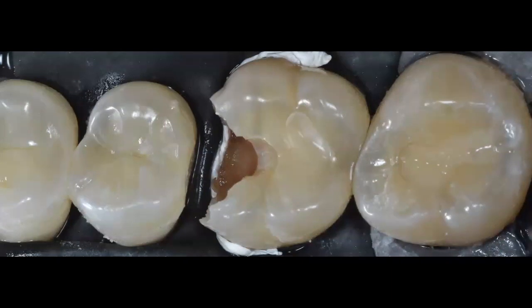Because the deeper you get into those areas with your bur to remove the decay, and as you can see, that's very soft dentin, I'm going to have to deepen that box. If the rubber dam is in the way, I'm going to tear the rubber dam, and now I'm losing the main function of the rubber dam, which is to stay underneath that gingival sulcus, so that I prevent that crevicular fluid from affecting this critical area, which is the floor of that box.